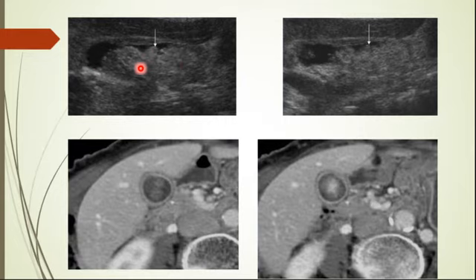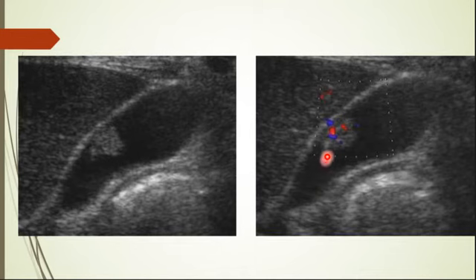It's hyperechoic, it's immobile, okay? While on the CT scan for the same patient, you can see it's just thick sludge filling the gallbladder. So not everything that's hyperechoic, without shadow, and doesn't move is a mass. It can be thick sludge. While if you see flow within the lesion, it's definitely not sludge, it's a mass.